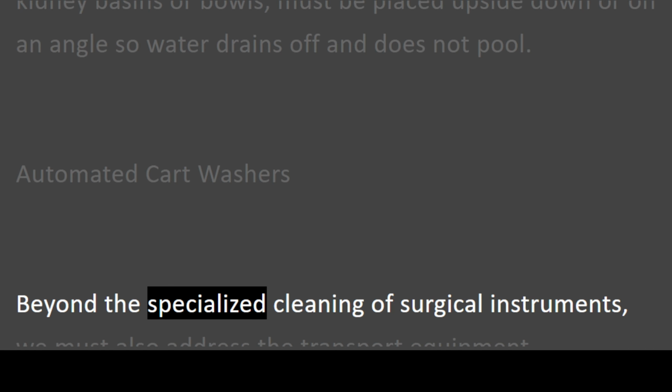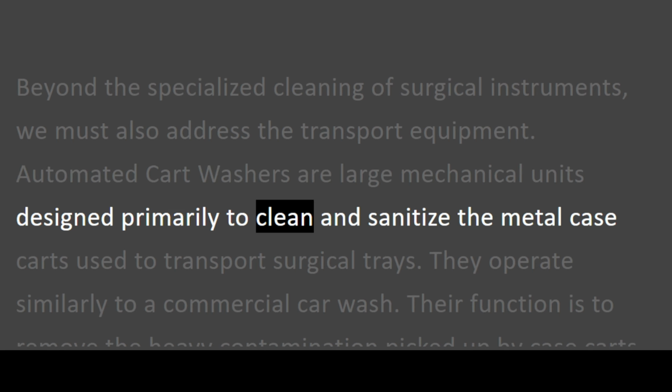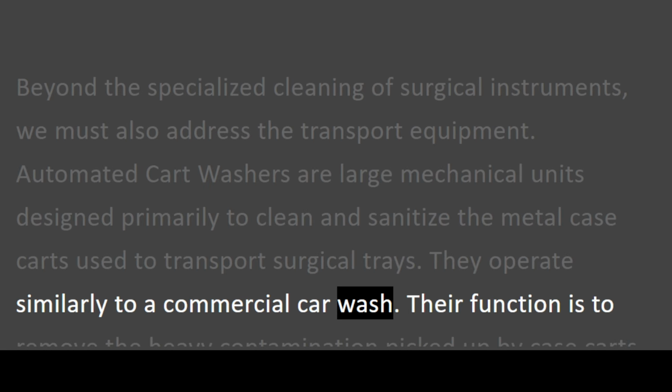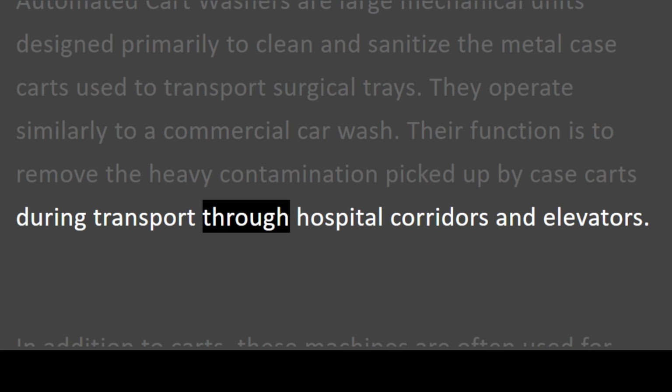Automated cart washers. Beyond the specialized cleaning of surgical instruments, we must also address the transport equipment. Automated cart washers are large mechanical units designed primarily to clean and sanitize the metal case carts used to transport surgical trays. They operate similarly to a commercial car wash. Their function is to remove the heavy contamination picked up by case carts during transport through hospital corridors and elevators.